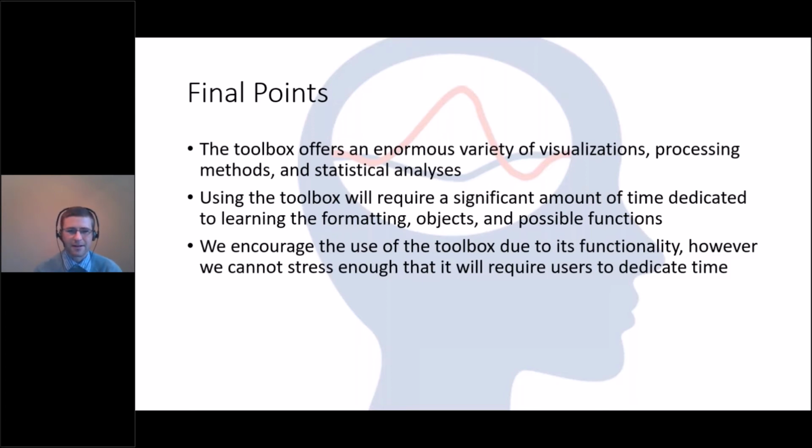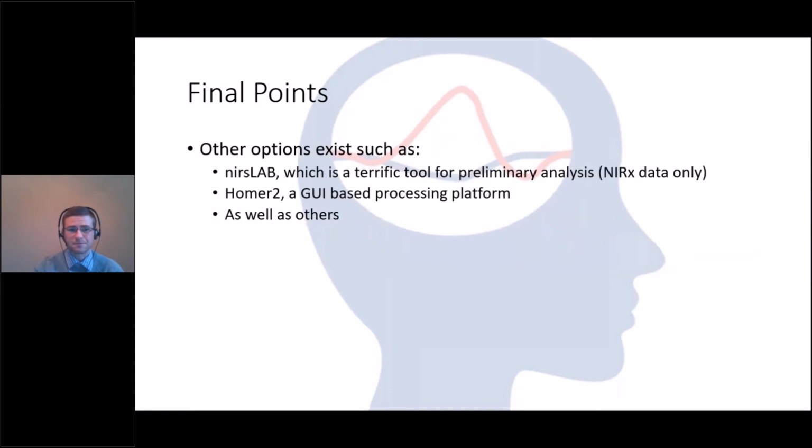YouTube is growing in the options for this. The documentation is growing for this, but it is a lot of digging. So it's a terrific toolbox to use. Once you get the hang of it, it is very simple to use, but the learning curve can be pretty big, and you will have to dedicate time to get through that.